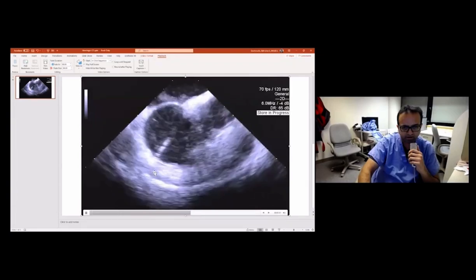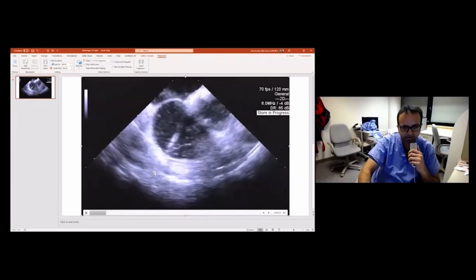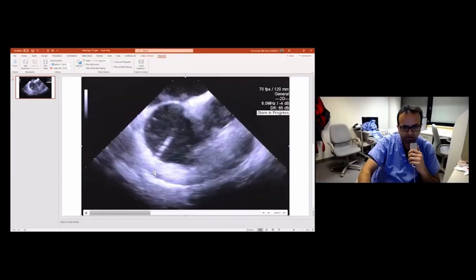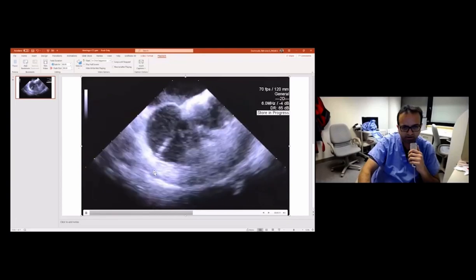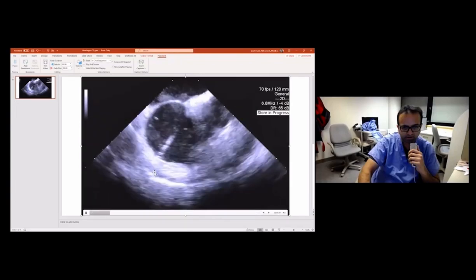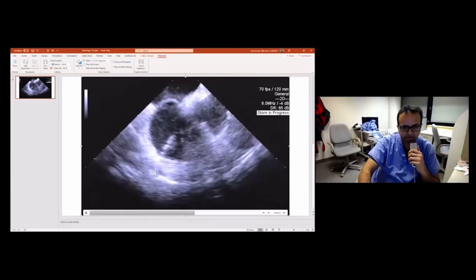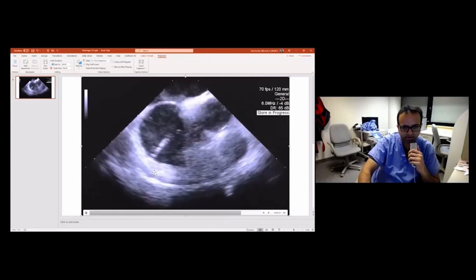But if there is any concern, we should certainly do a coronary angiogram. If we are looking too atrial, again, the chance of damaging the phrenic is going to be low. But if you are seeing more and more ventricular electrogram, which is much bigger, then we should not ablate. And if that is the only way we are able to ablate this, then checking for phrenic becomes important.